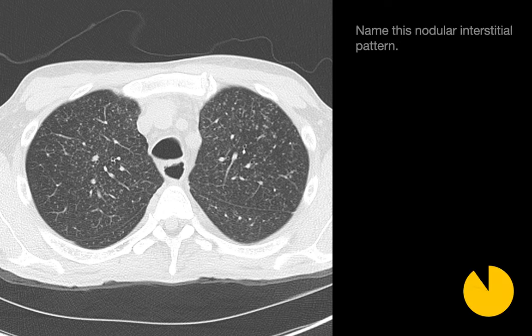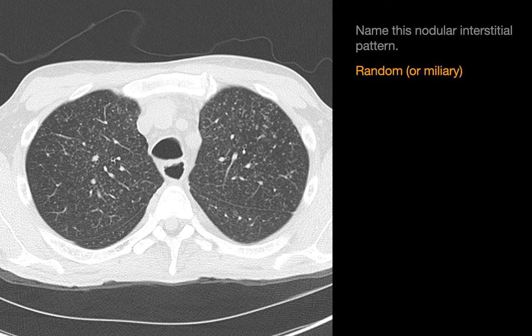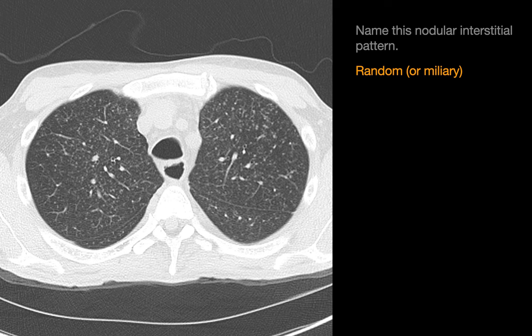Name the nodular interstitial pattern on this image. The pattern we're looking for here is a random or miliary pattern. The features of a random or miliary nodular interstitial pattern are lots of tiny micronodules that are of relatively uniform size.